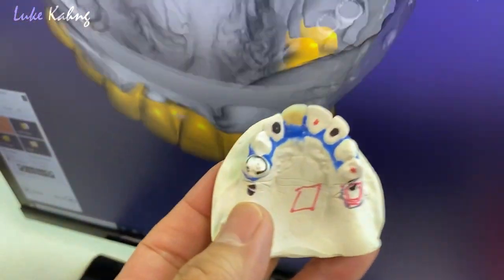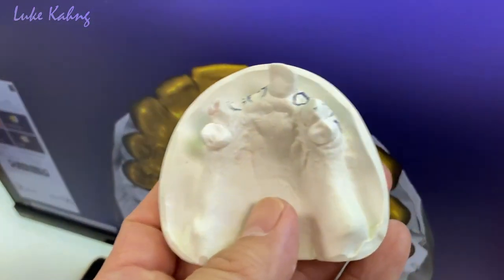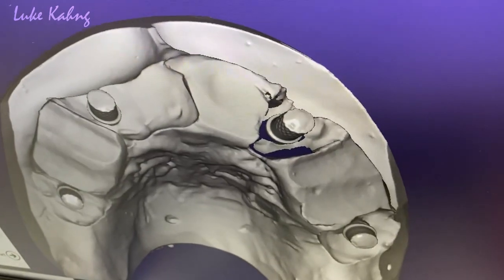This is the design from before, and then we're going to see it better — without this implant. Okay, that's the eye grinder.